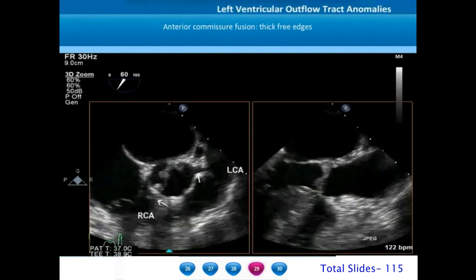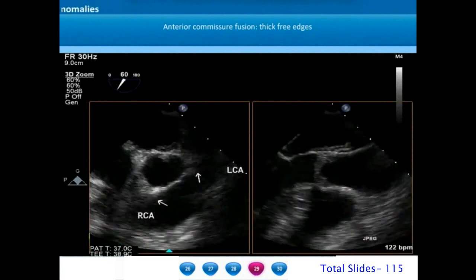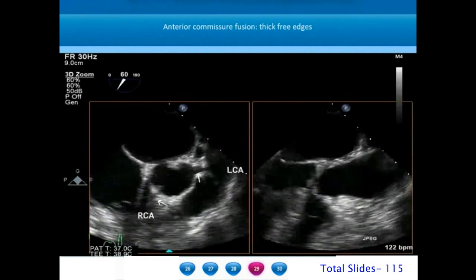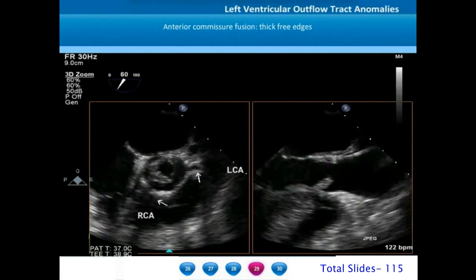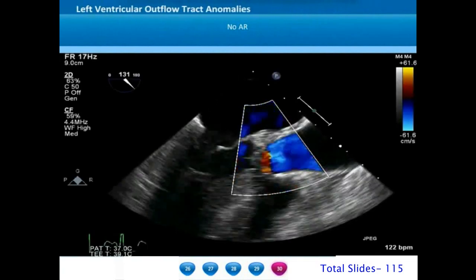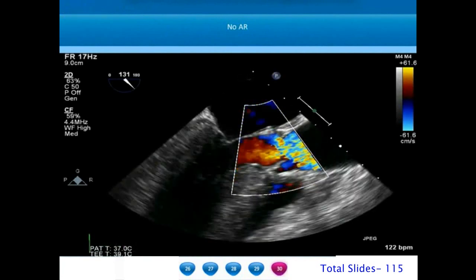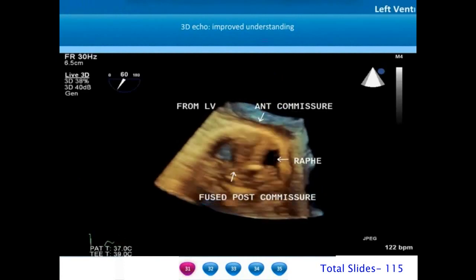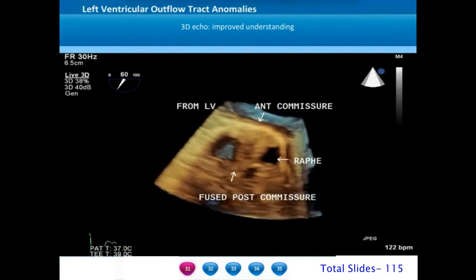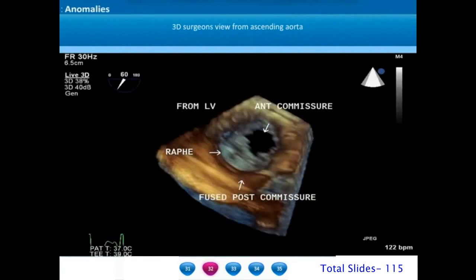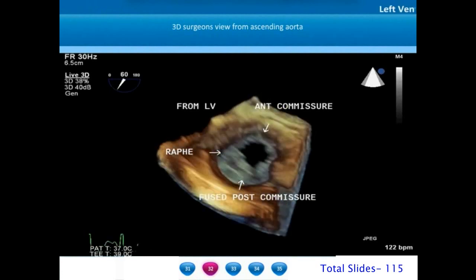On x-plane imaging we can identify both the short axis and long axis simultaneously. On short axis we identify the anterior commissure which is fused and the free edges are very thick. When free edges are very thick they usually don't get torn during valvotomy. We also need to exclude significant aortic regurgitation before resorting to aortic valve valvotomy. On three-dimensional echocardiogram the aortic view of the valve shows the fused commissure and thickened free edges far better on the 3D surgeon's view from the ascending aorta.